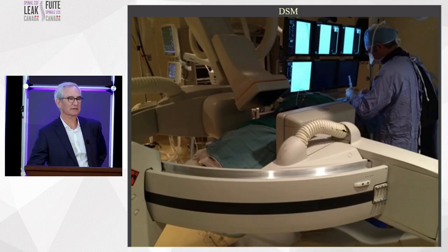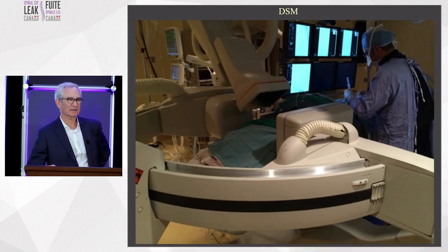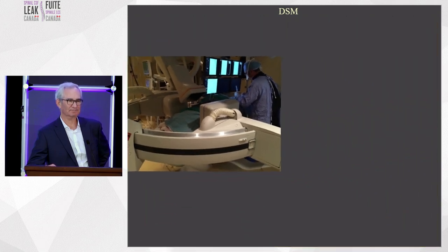This is how we started out over 10 years ago after I went down to Cedars-Sinai to see how Wouter, Shavink, and Marcel Meyer were doing myelograms. Came back and I tried to reproduce it. Our machines were good, but not as good. We couldn't do a direct frontal lateral view. We couldn't get in our biplane angio, neuroangio suite and actually do it. So we quickly figured out a way to do it in our center.